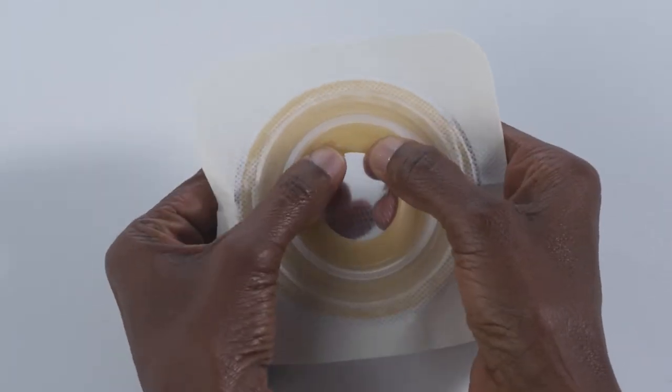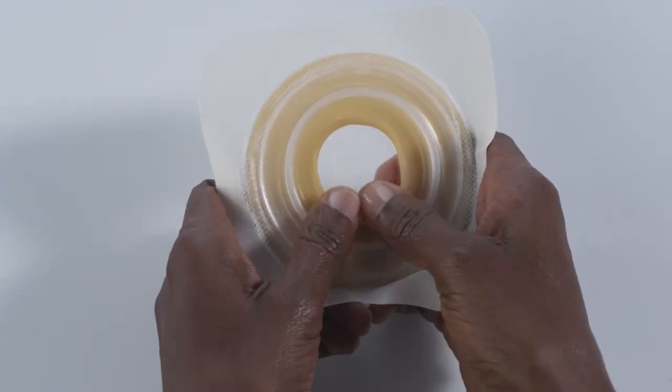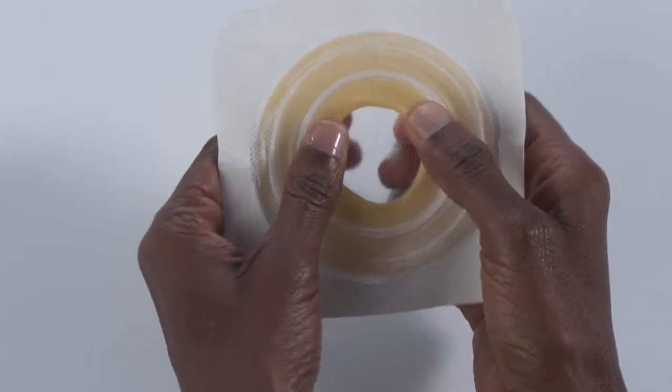Do not stretch, pull, or cut the adhesive to make it bigger. Once you have rolled the opening to the best fit for your stoma, gently press down on the rolled portion to hold its shape.